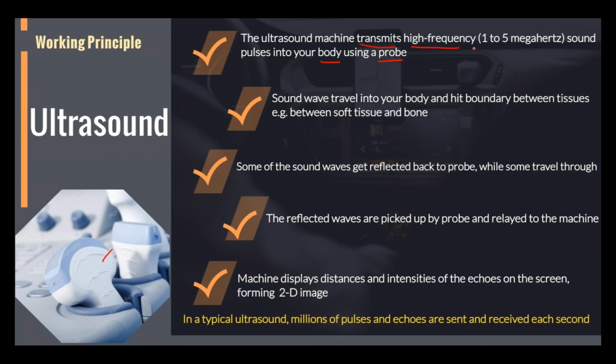You know the basics: refraction, reflection, absorption and all those parameters you have studied, right? So Snell's law, you know everything. When sound energy goes and hits some medium, your tissue will definitely have a tendency to reflect back. Okay, so second thing, the sound energy travels into the body and hits the boundary.